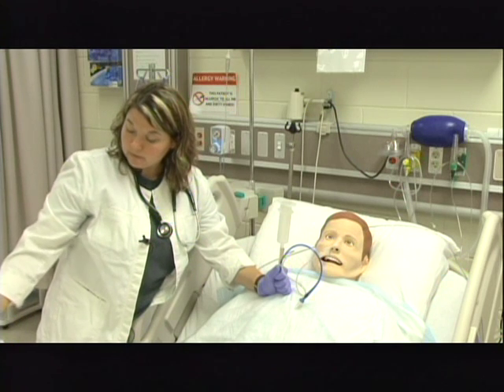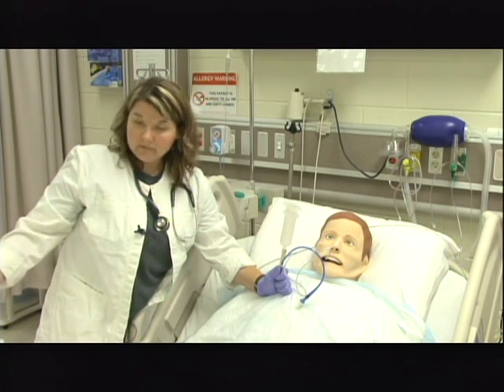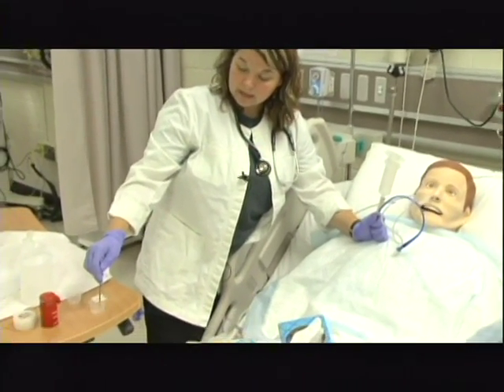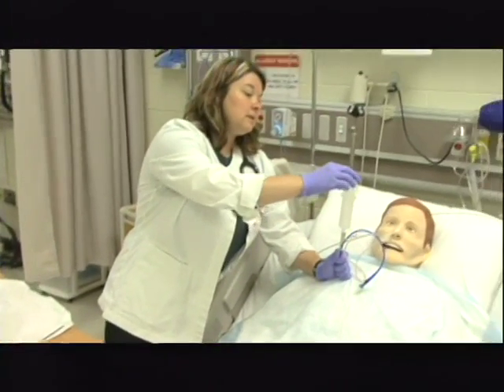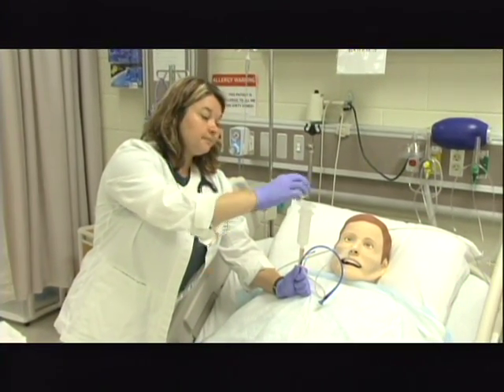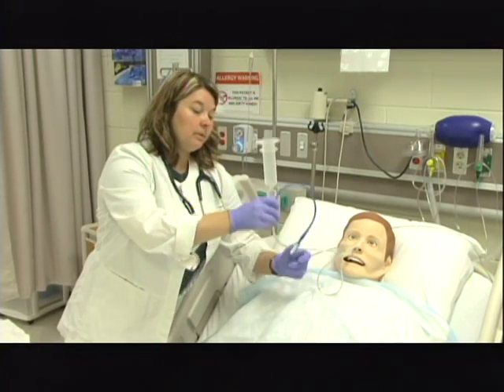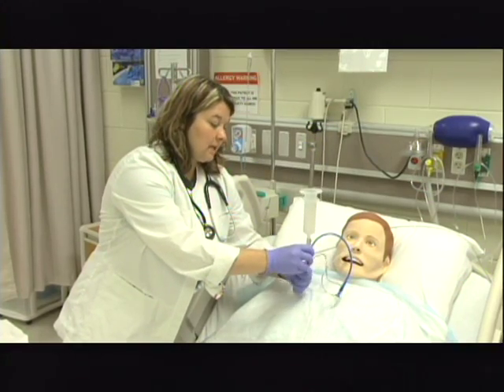I'm now going to come over here, and my medication is mixed up with the 10 milliliters of solution. You can have your little straw over here for each medication if you want, because you don't want to mix them up. And you can agitate it a little bit here to mix it up. Come and put the 10 milliliters of the medicine in here. Once I've got that medication in here, I can now unclamp and let the medication instill by gravity. Again, I want to come back down and reclamp it.